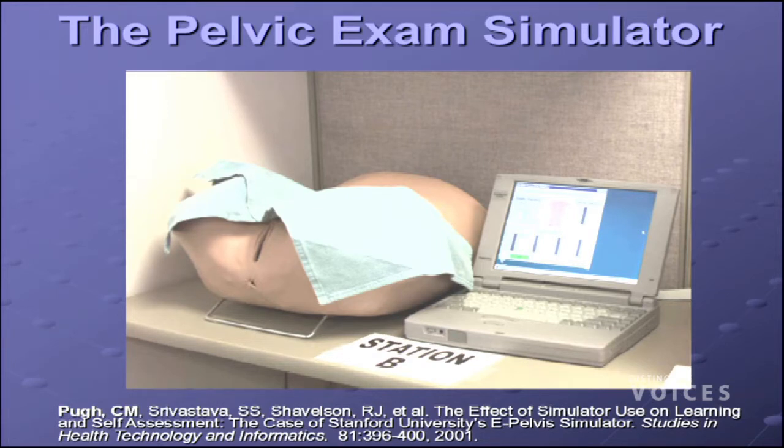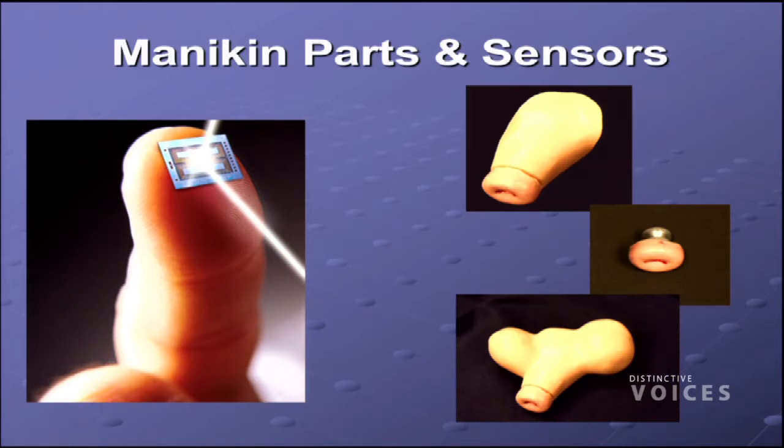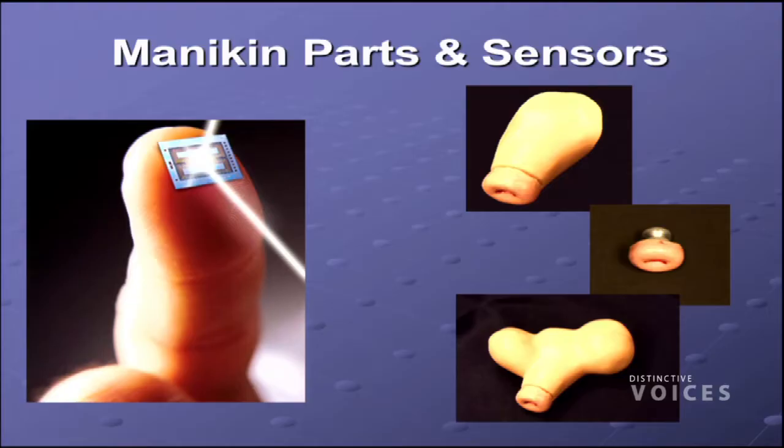But this is the first simulator I built. And basically what we did, and this is not one of the sensors I used, this is another sensor. The ones I had were a lot smaller and really paper thin, and we mounted them on various organs. These are 3 internal organs that come with the model. So the model looks the same on the outside, but the skin comes off, and you can change the internal organs. The one at the top is a normal cervix and uterus. The cervix you can change, and that had some abnormalities or options for abnormality. Obviously, the one below is a horribly abnormal uterus with fibroid changes.